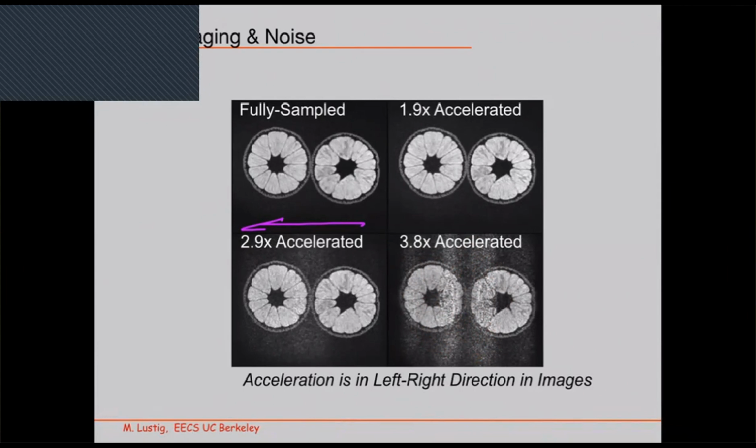So there are coils around it in this direction, right? Well, I don't know exactly how the coils are, but probably 8 coils, I think. And you accelerate in just that one direction. The phase was that way, but the noise went that way. Did you expect the noise to go that way? Yeah, because I try to combine 2 pixels, like one here and one here, to result in this. Because you accelerate only in this direction, the coil sensitivities vary such that these areas are very ill-conditioned.